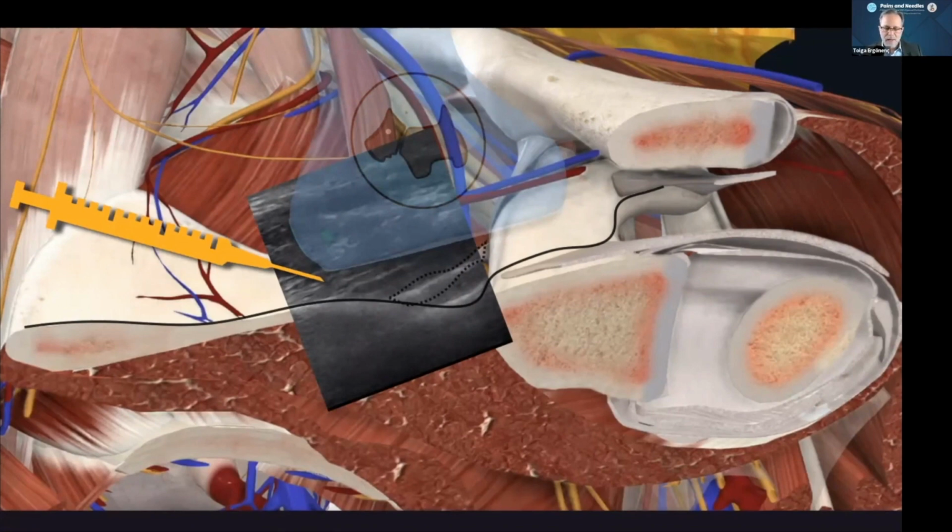It's not exactly ablation, because we don't want to ablate this nerve due to motor function. I prefer the pulse radiofrequency. It's not a real ablation. It's just neuromodulation for long term shoulder joint pain relief. And you can see the spinoglenoid notch here as well, but I usually prefer to perform my procedure at the suprascapular fossa.